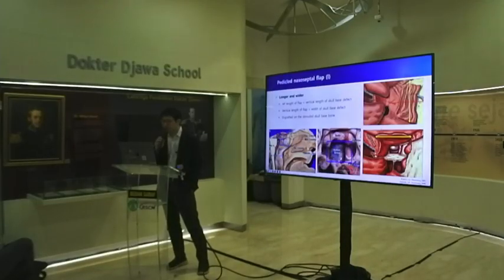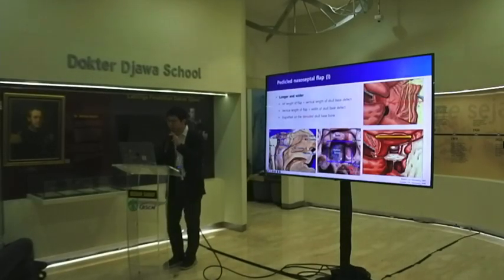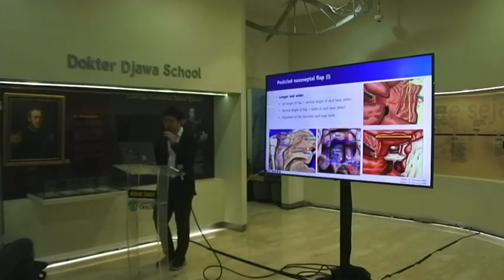The pedicled nasoseptal flap is a vital tool for skull base reconstruction. We can use techniques like bilayer button or gasket seal, often in conjunction with fat and other sealant. This flap is designed to be longer and wider than the defect to ensure proper coverage. So this AP diameter can be fit to the exposure of the skull base, and the vertical diameter is fit with the dimension of the skull base defect.